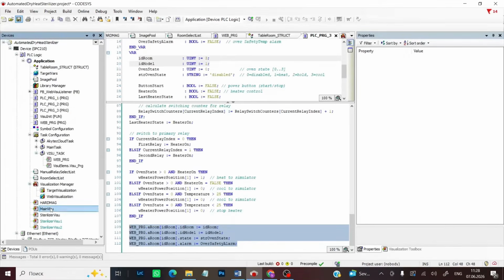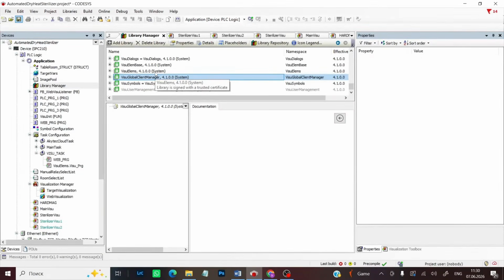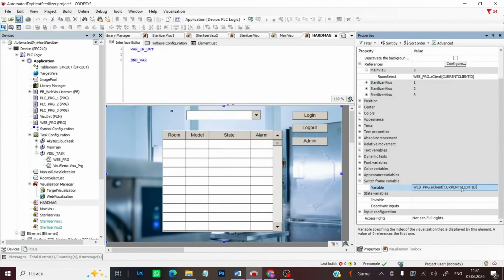These values will be displayed in the table on the main visualization. For the instance of our main page, I linked the Room Select field to an array element that will store the page number for each unique client connected to SPC210 via a browser. The index of the array element uses a global variable that holds the unique client value. This variable will become available after we add the Visu Global Client Manager library to the Library Manager. I also linked this same array element to the Switch Frame variable field, which controls switching between our visualization pages.